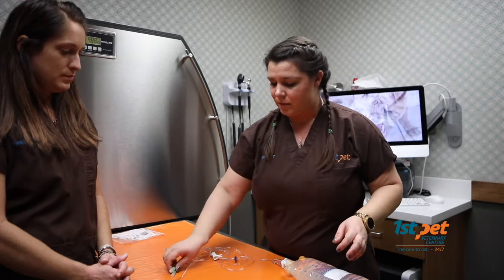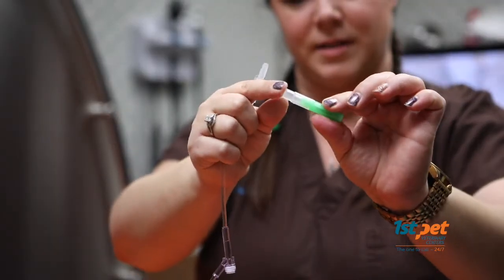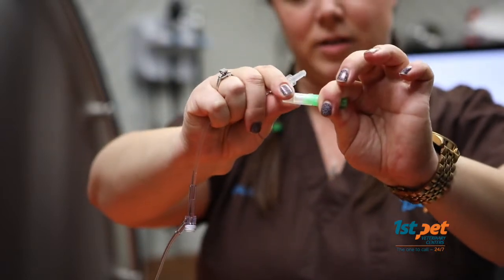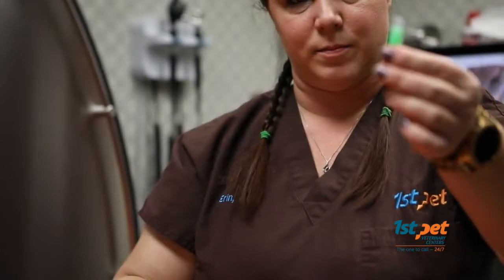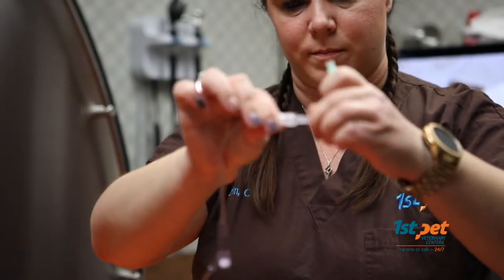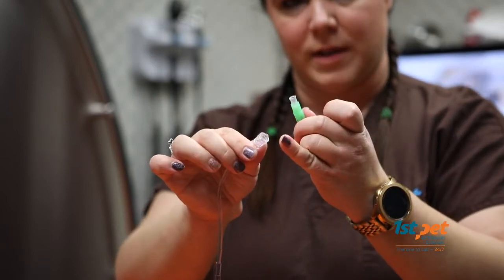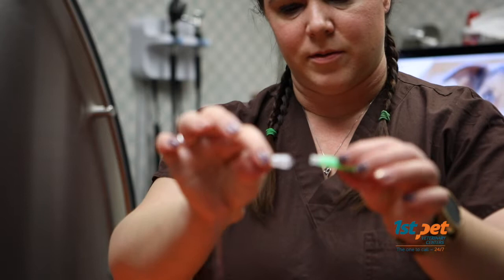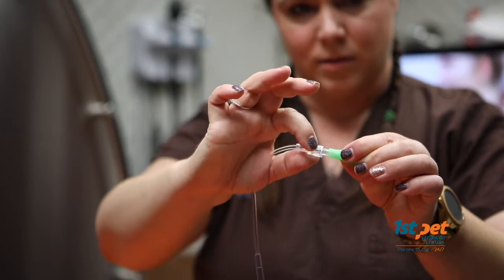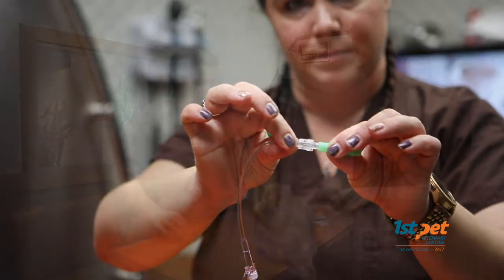And then lastly, in order to stick the needle onto the line, you have your 18 gauge needle. It has a plastic piece at the end. You're going to carefully twist it off until you hear a click sound. And now our needle is pretty exposed. On the end of your fluid line, you also have a little plastic piece. Again, very important to make sure that you're not touching the end of your needle or the end of your fluid line. And then you will carefully stick your fluid line into the tip of the needle and give your little line a twist up. Now this has locked your needle in place to the fluid line.